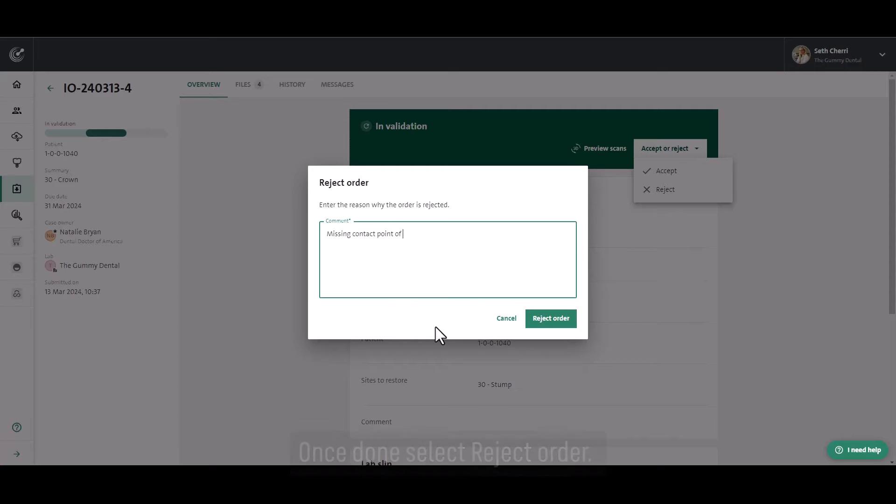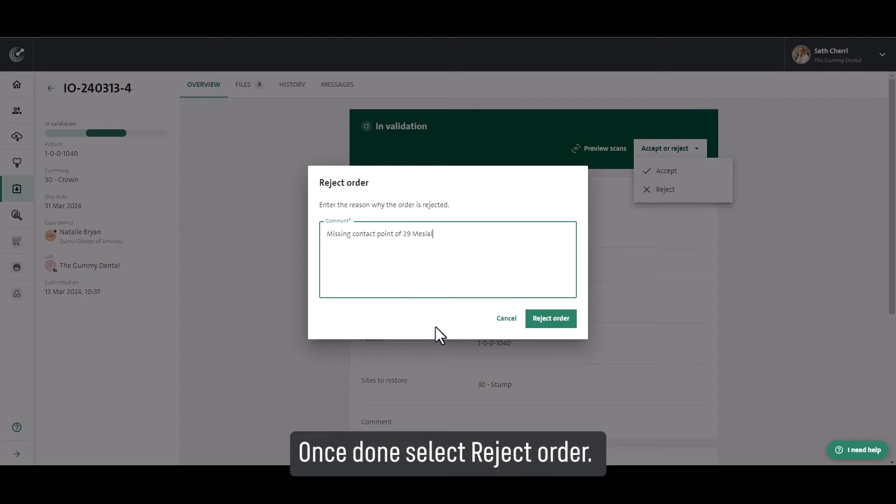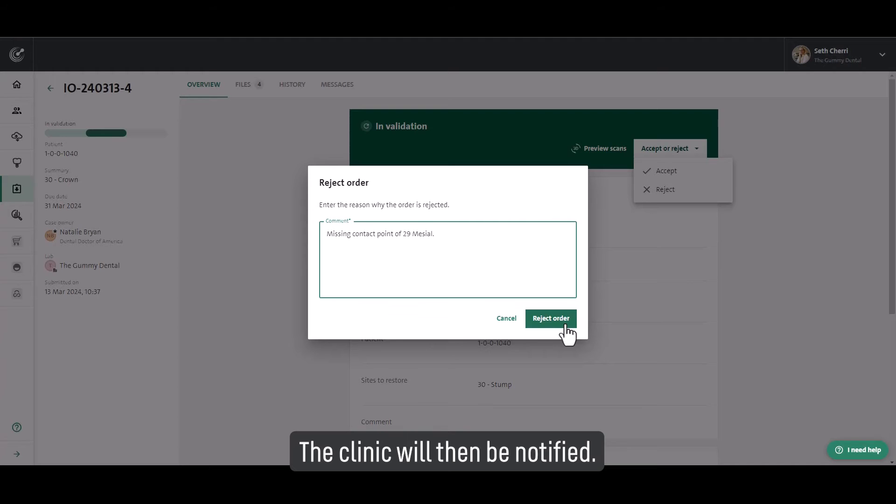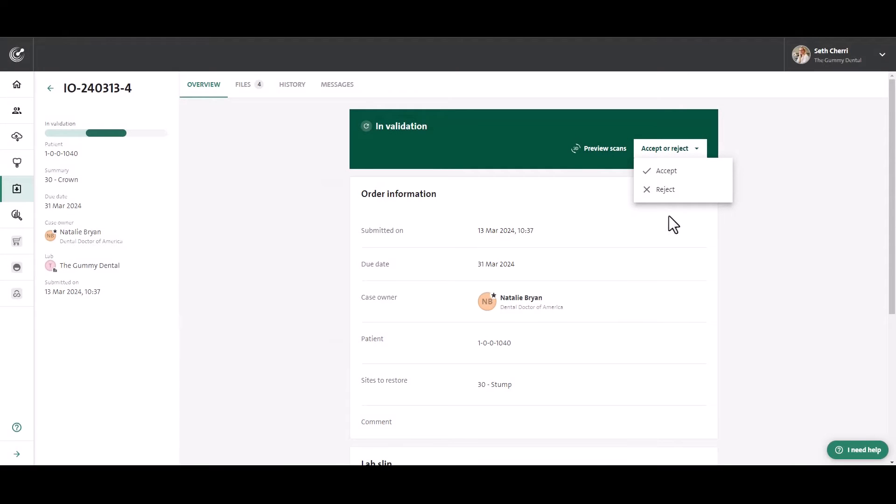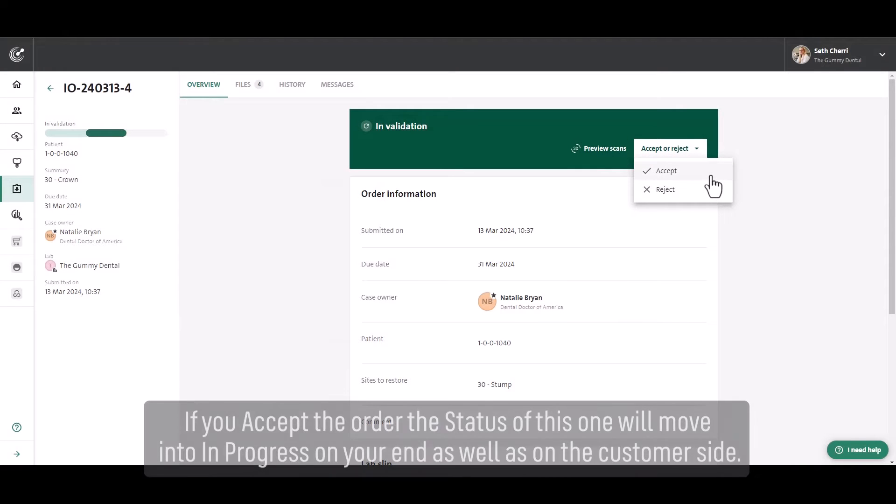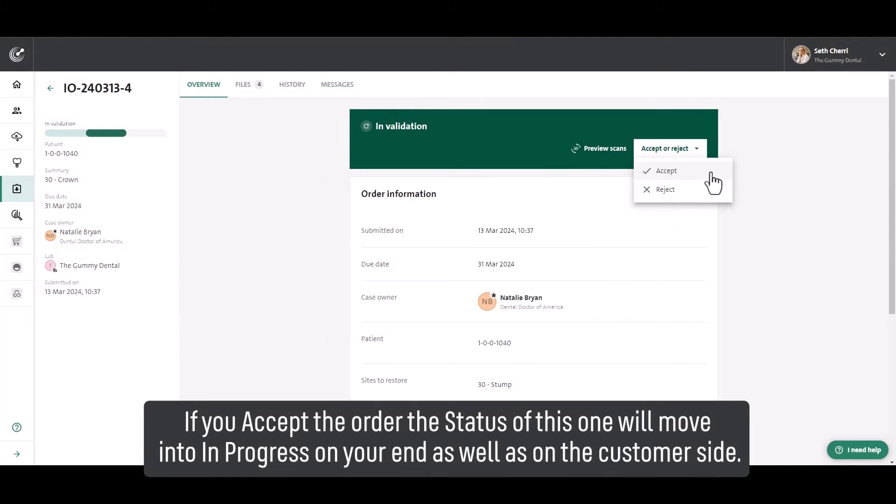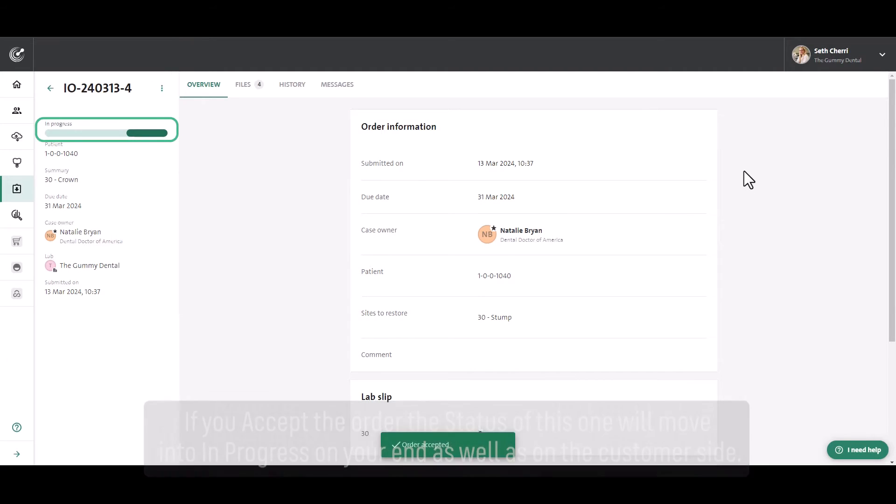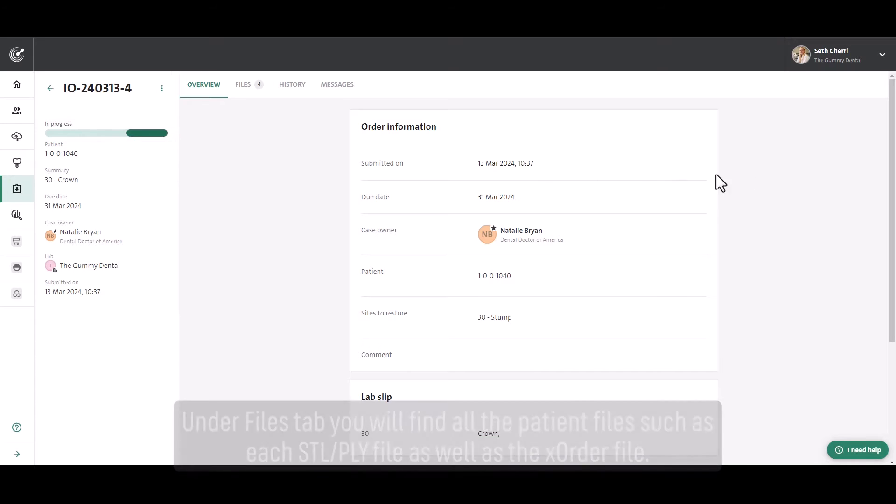Once done, select reject order. The clinic will then be notified. If you accept the order, the status of this will move into In Progress on your end as well as on the customer side.